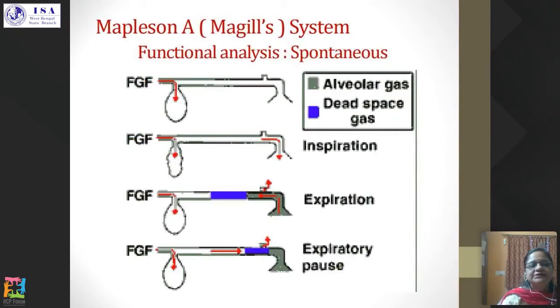In this picture, you can see the alveolar gas coming, and this is the dead space gas, the blue color.